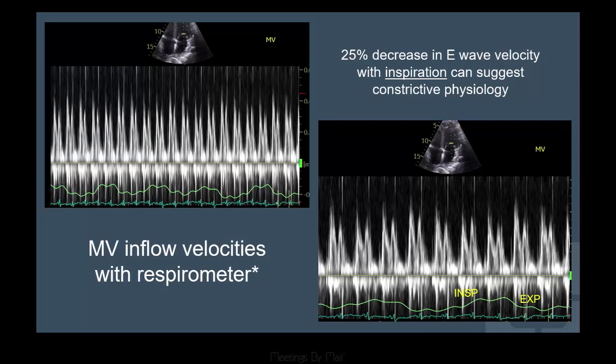Change your physio leads from 1, 2, 3, wherever you can pull that in best, because especially for your pericardial patients, that respirometer really is a source of a lot of good information for our doctors. So those are just some technical tips. Again, make sure your sample volume is right, that it's placed at the leaflet tips, as we do with all diastology things. It can be tricky, but I really encourage you to move stickers, make sure you're on a bone, and make sure that you play with your respirometer settings. Okay, thanks, Jenna.